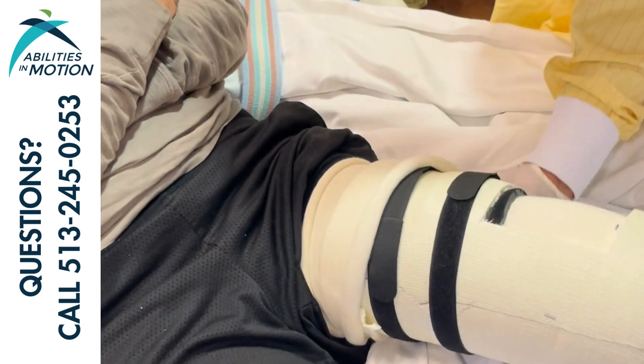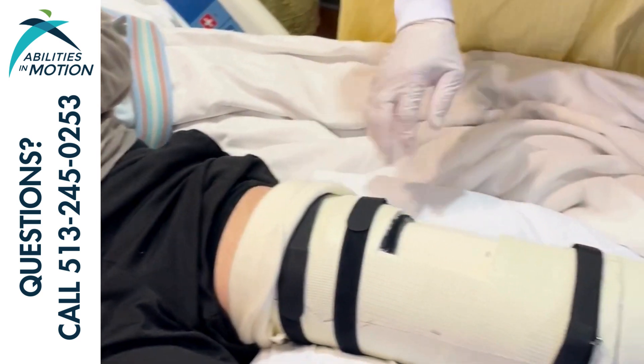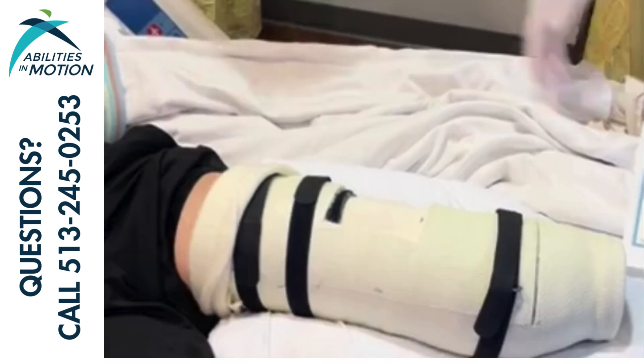Tom's pulling the socks down now over the top brim of the cast — one, to protect the patient's skin, but two, to make sure that the socks aren't all bunched up inside of the cast either.